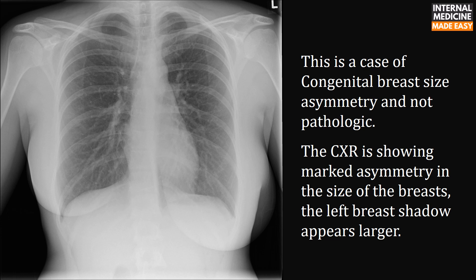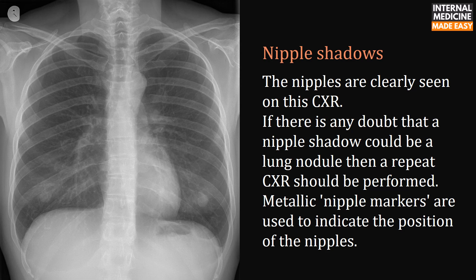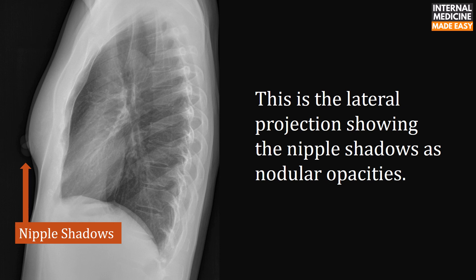This is a case of congenital breast size asymmetry and not pathology — the x-ray shows marked asymmetry in breast size, with the left breast shadow appearing larger. Regarding nipple shadows: the nipples are clearly seen on this chest x-ray. If there is any doubt that a nipple shadow could be a lung nodule, a repeat x-ray should be performed; metallic nipple markers are used to indicate the position of the nipples. The lateral projection shows nipple shadows as nodular opacities.